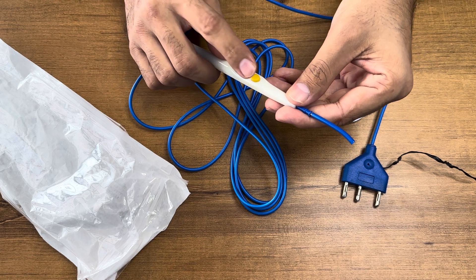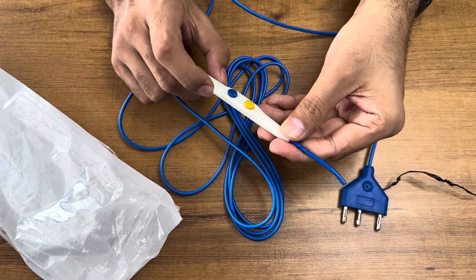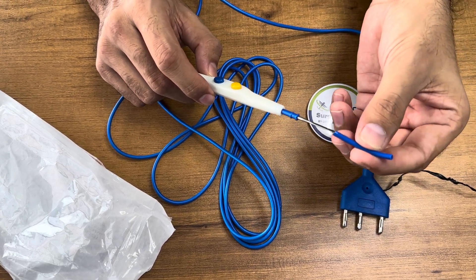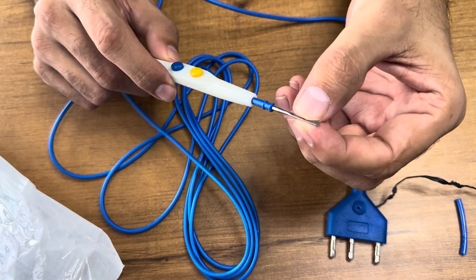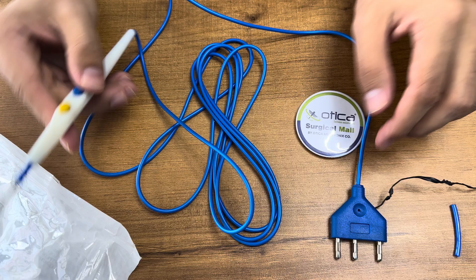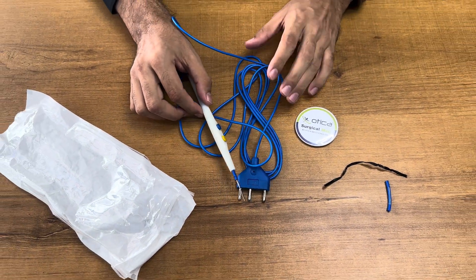This comes with two buttons — one is for cut, as mentioned, and one is for coagulation. You just need to remove the safety guard from the tip. You can see it is fine quality and the buttons are properly operated. This is the 3 meter ESU pencil, or we can say a cautery pencil.